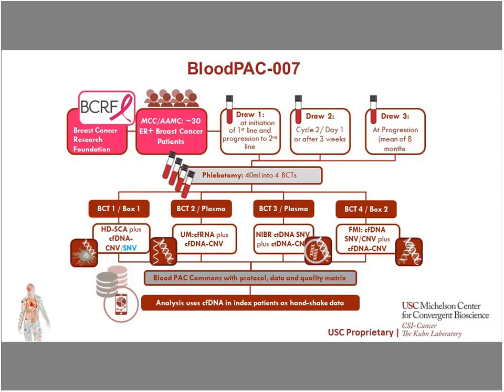So our lab will use HD-SCA plus Oncomine Breast Cancer Assay V2 to analyze the first blood tube, BCT1, and we commit to share data on the HD-SCA on CTC morphology, genomics, and proteomics, with simultaneous genomics on over 100 patients with breast cancers.